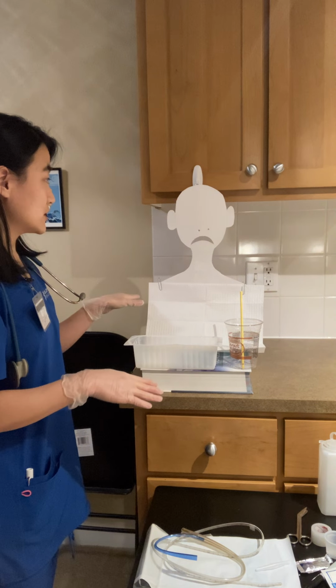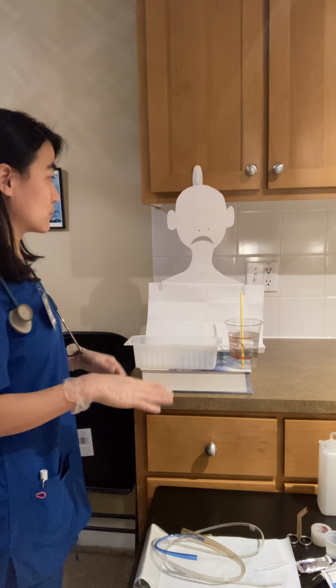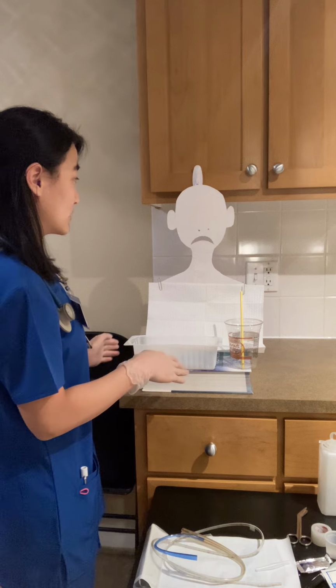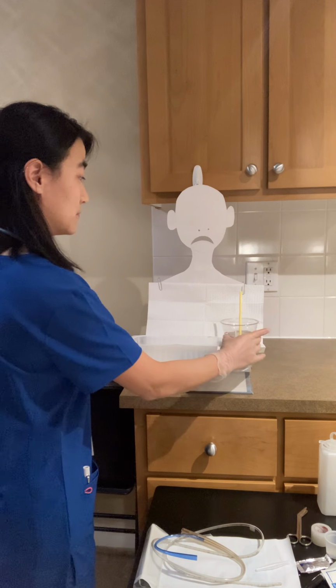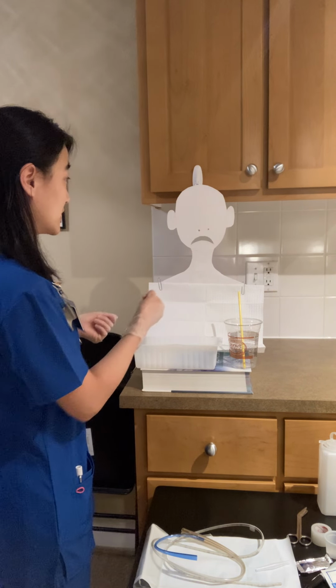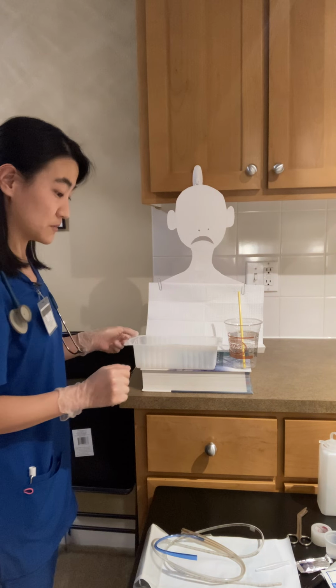So during this process, you're not going to be able to talk, so if you feel any discomfort or want me to stop, go ahead and just raise your index finger. Also, when I instruct you to do so, you're going to want to tuck your chin and then take sips of water from this cup, and then I will be moving the nasogastric tube forward every time you swallow.